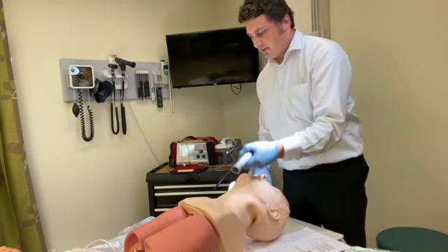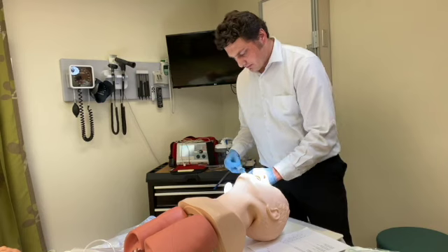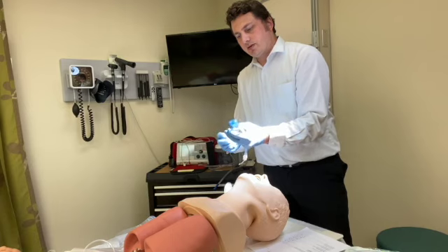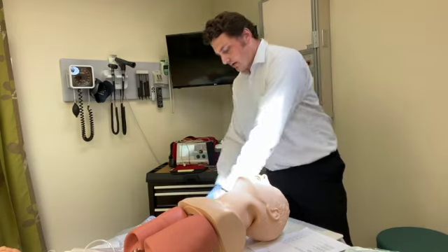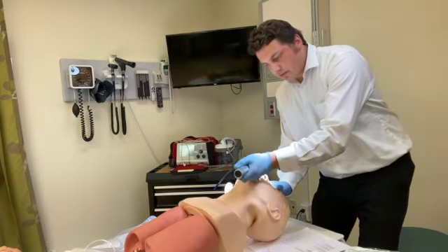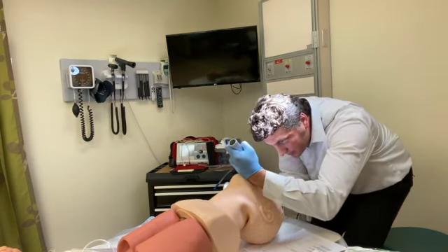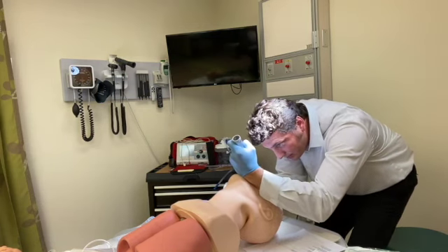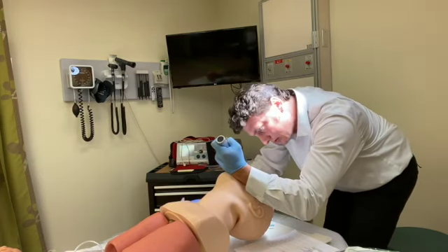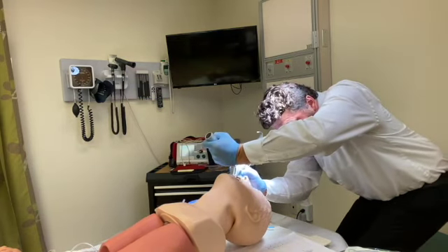and you probably want to check to see if the bulb inflates of the actual tube. Right, so it is working. So you want to remove the air in that case. Okay, your stylet ready to go. So sweep the tongue, move it laterally, and you want to see the vocal cords. Okay, so 45 degrees up and out, and then you're going to want to place the tube right under that glottis, which is where the vocal cords are.